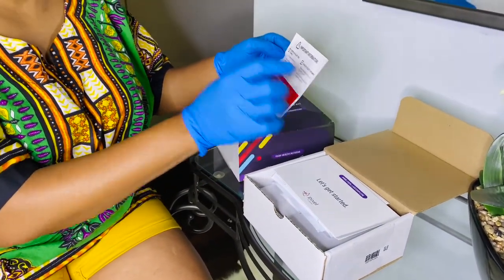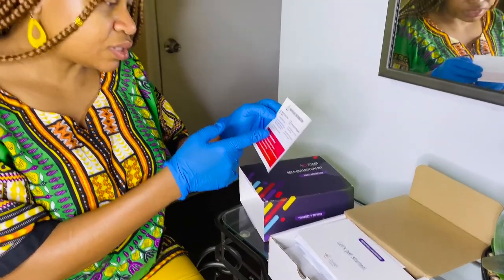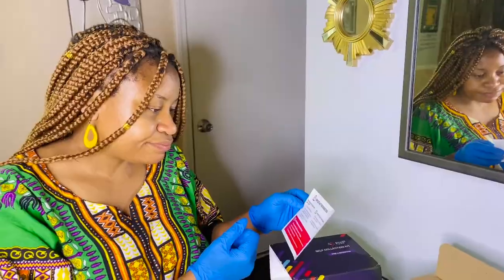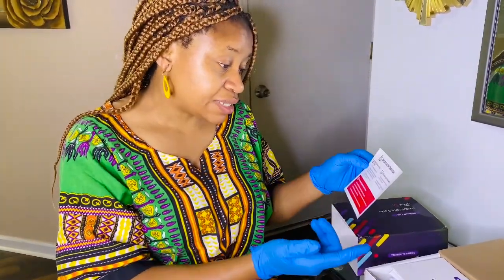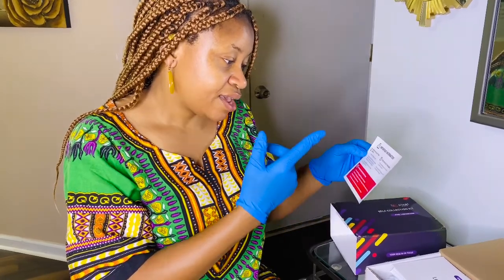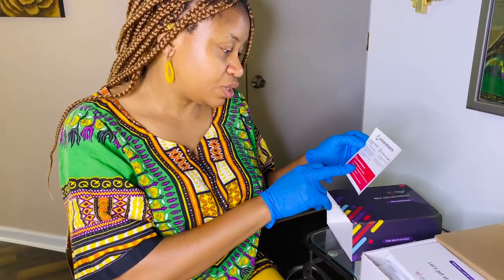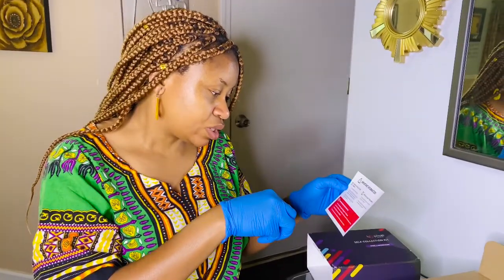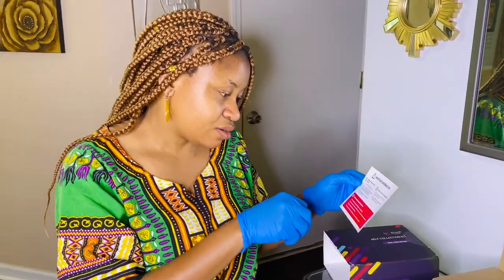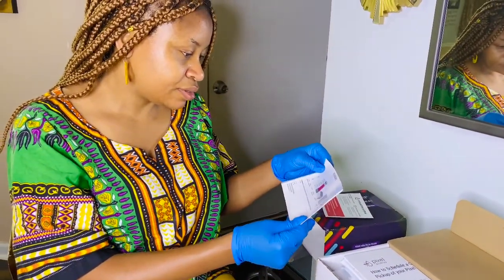Important information before you collect your sample. Is it a weekday, Monday to Friday? Have you confirmed FedEx drop-off or pickup? Will the sample be picked up on the same day as you collect it? So after I collect my sample, I have to go register this kit on my Pixel by Labcorp account. Have you placed both the gel pack and your sample in the foil pouch? Your sample may be rejected if you fail to include both the sample and gel pack in the foil pouch. Drop off at FedEx on a Saturday or Sunday, or after the last pickup of the day. Schedule a FedEx pickup on a Saturday. Try to drop your sample at a FedEx office rather than a drop-off box. Oh well, today is not Saturday. Let's get started.